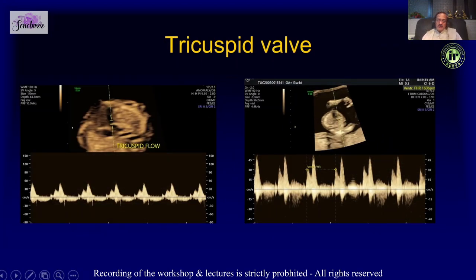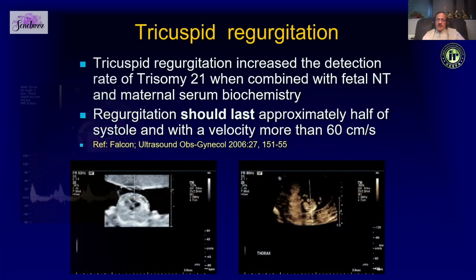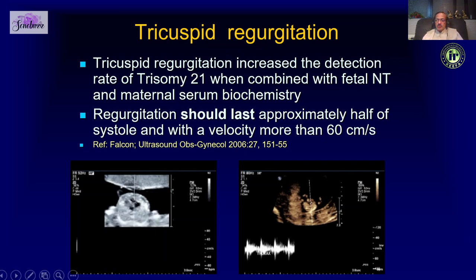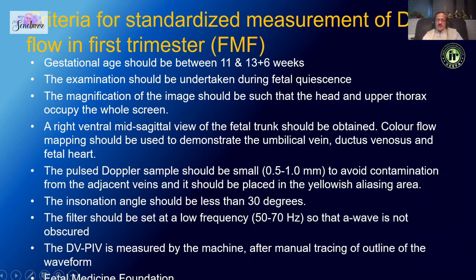We also assess the tricuspid valve. The picture has to be adequately zoomed, and you increase your sample size to cover the tricuspid valve well. That is the normal tricuspid valve with the E-wave and the A-wave — normally you might see a little regurgitation but it should not be more than minimal.